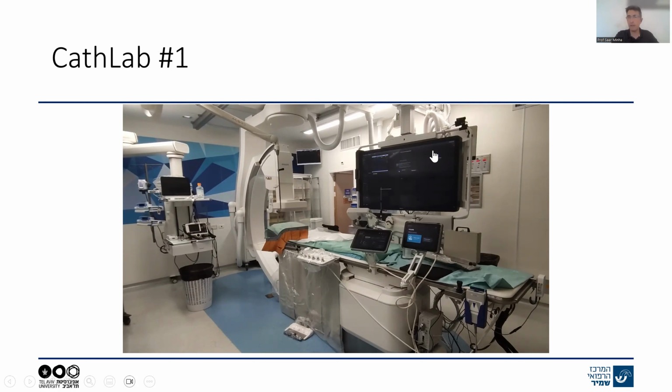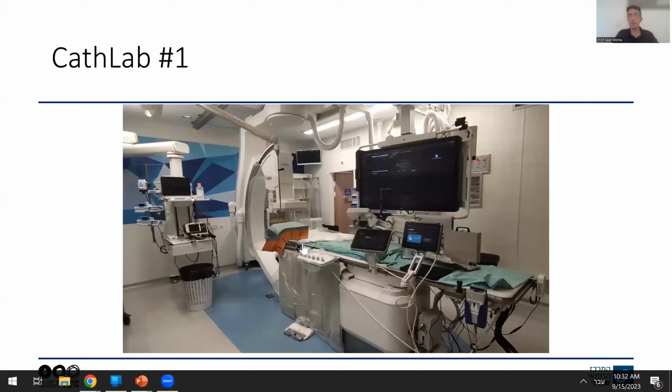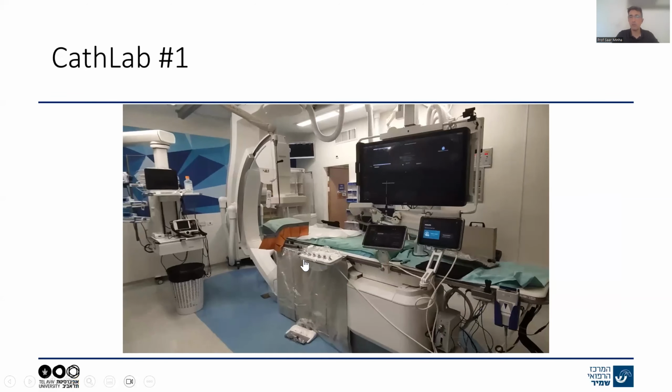When I started working in cath labs, we had 4 to 6 different split screens. Nowadays, we have a multifunctional huge screen that is controlled by this touch screen here, which I'll elaborate on in a second. As you can see, in our lab we have 2 different touch screens. I, as an operator, stand here. The patient is lying on this maneuverable floating bed. I have my basic control over the C-arm from this control panel here, and I can move the C-arm in different directions. To get from one projection to the other, instead of moving the patient, all I need to do is change the angle of the C-arm, and we'll see that in a sec. So again, let's just go a tad forward.